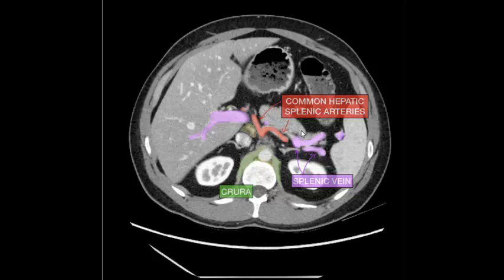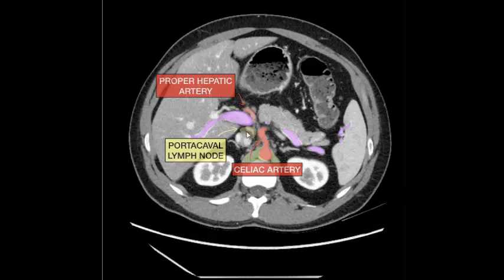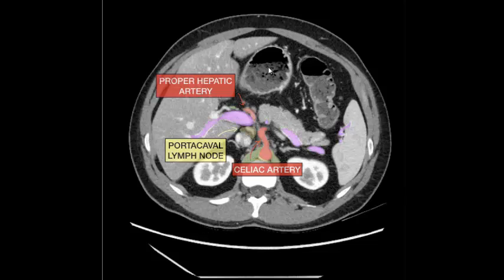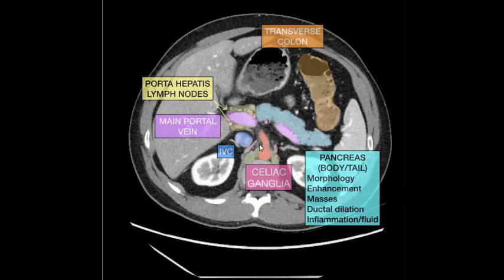Pancreas, body of pancreas. Proper hepatic artery, portal vein, portahepatic lymph nodes, celiac artery, crus of diaphragm, splenic vein, spleen, body of pancreas, tail of pancreas, transverse colon, stomach, portahepatic lymph nodes.